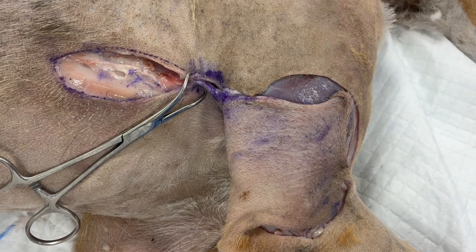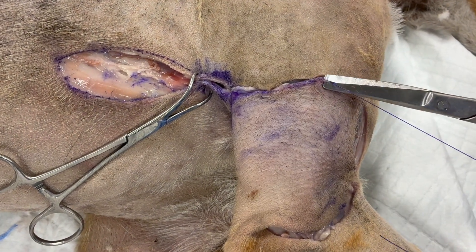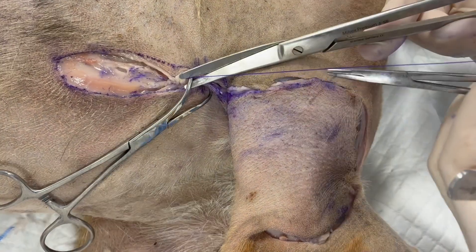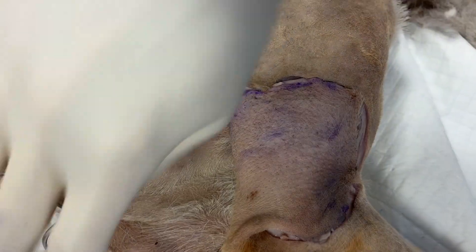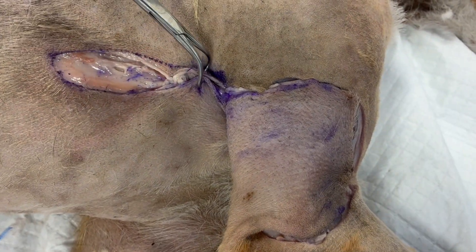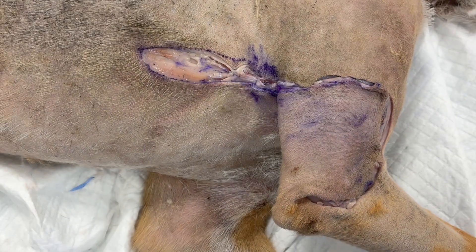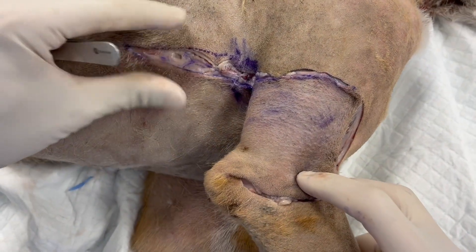Here are a series of additional interrupted sutures for the flap, and note that we have minimal tension. To finish this off we would add a few more deep subcutaneous sutures and come across this with a superficial subcutaneous layer, then add our skin sutures on top of that.